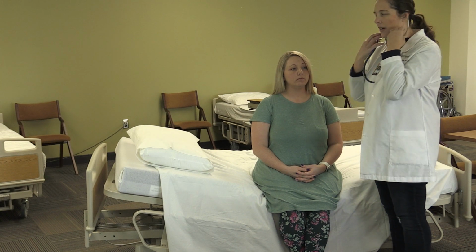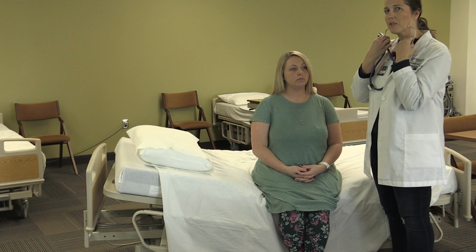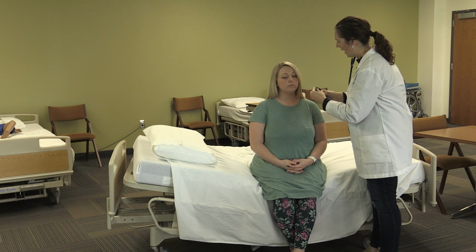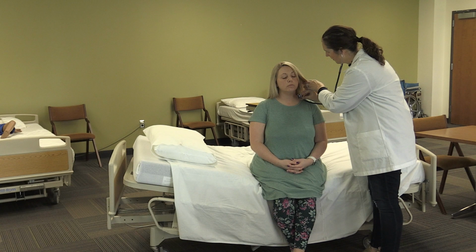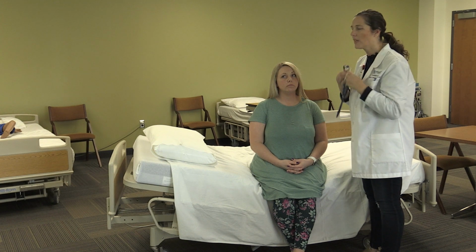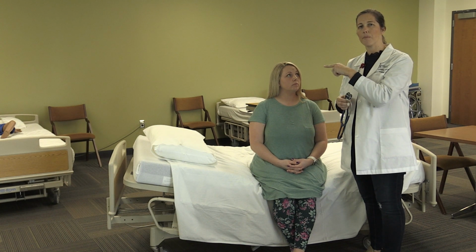Okay. For this particular assessment, we're going to use the bell of our stethoscope. And I'm going to have you hold your breath. And then I would listen to this on both sides.